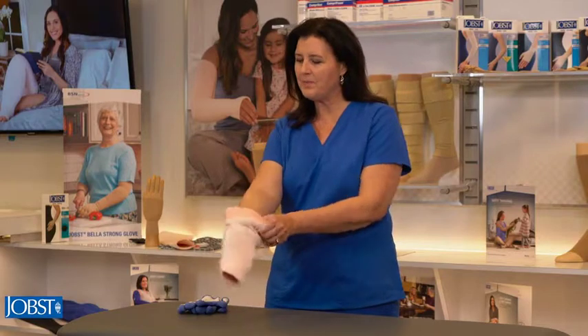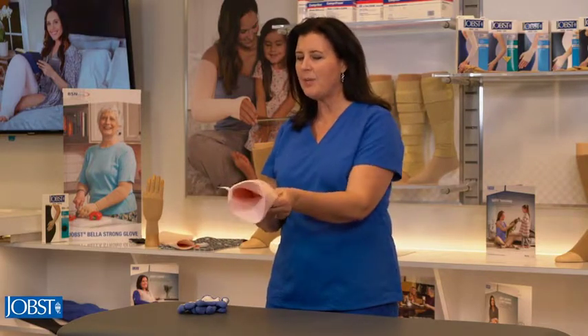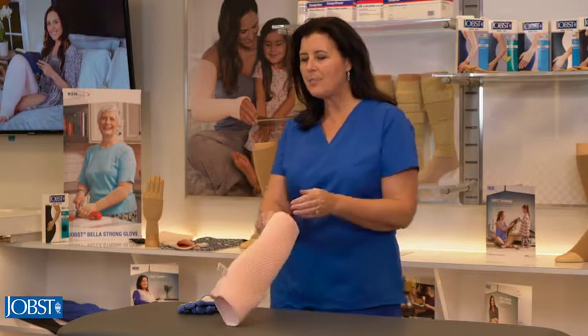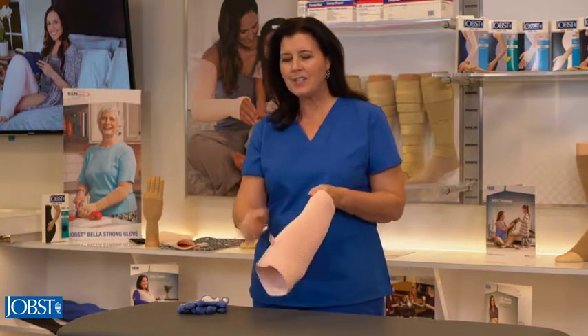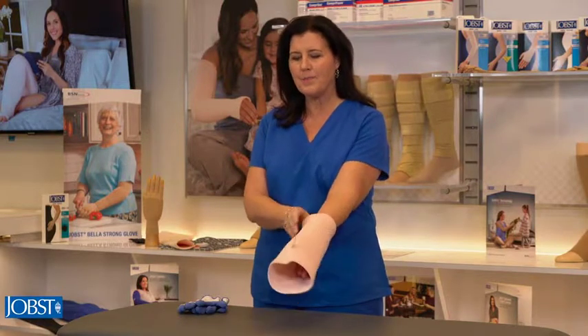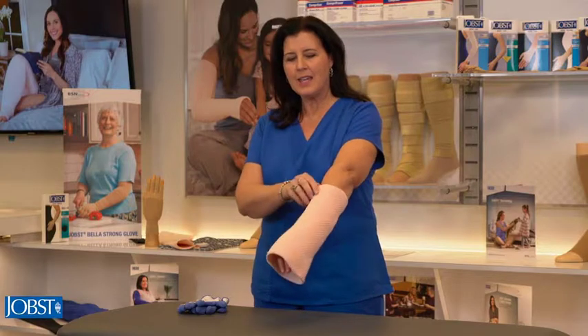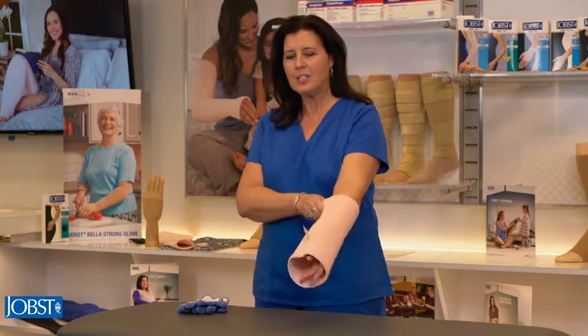We're going to turn the sleeve inside out a little more than halfway. When you see the elbow you can stop there. As you can see there is a seam in the garment — we're going to align the seam with our thumb. Then we're going to pull the Jope's garment on until it reaches our wrist.